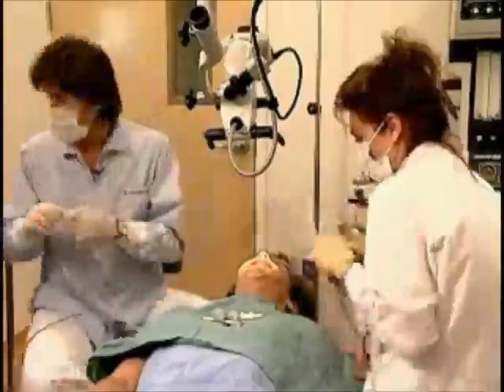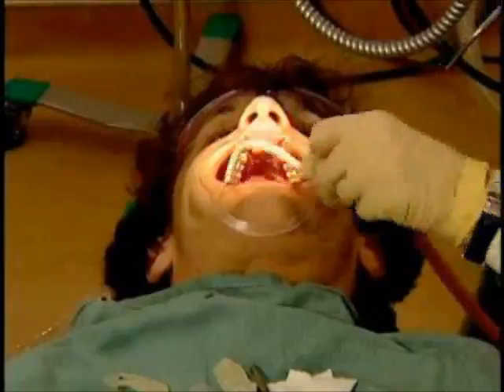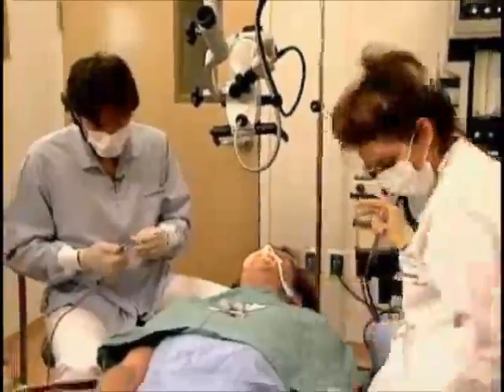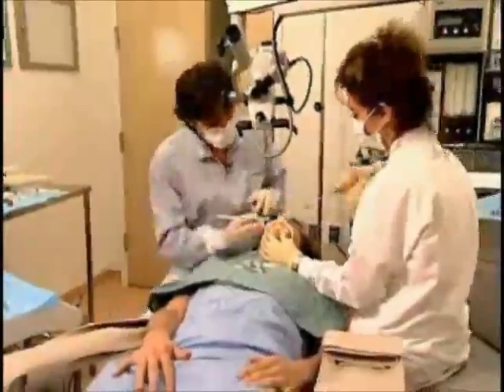Now we're going to change drills, go to the next size, the 2.8. This will be the last drill for this particular implant that we're using. So there's only two sets of drills, the 2.3 and the 2.8, and we'll go to the implant body.